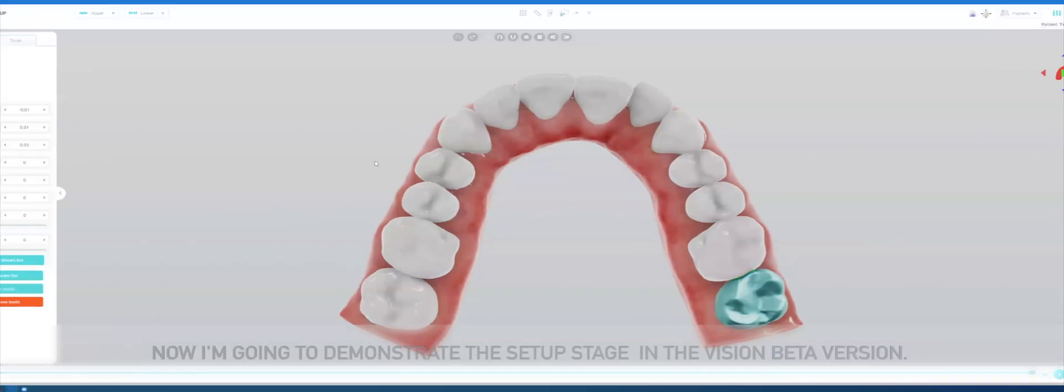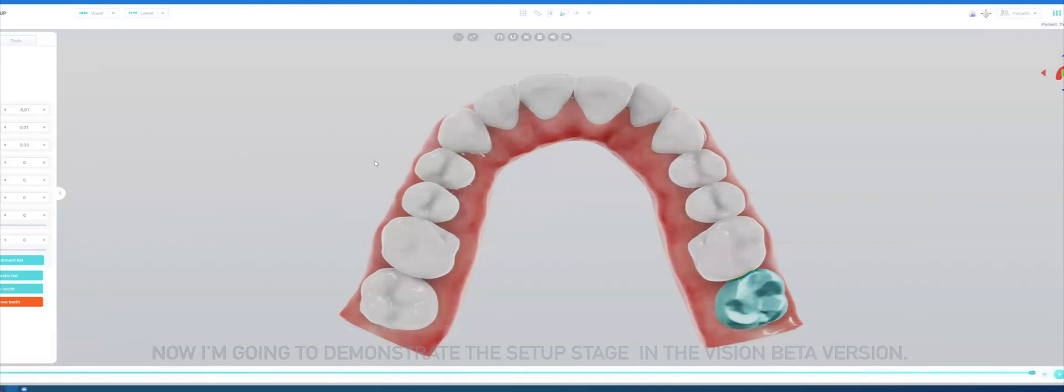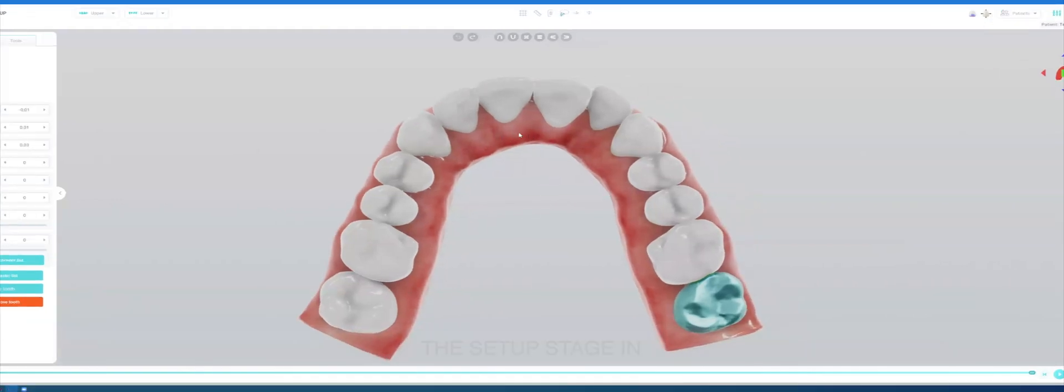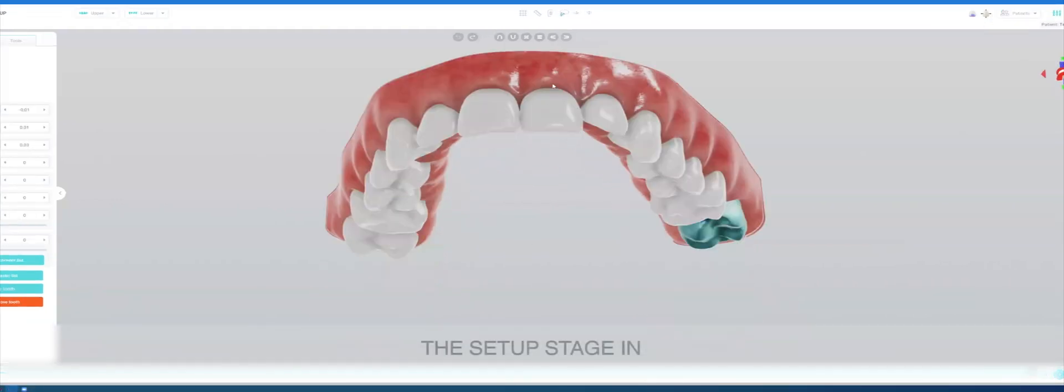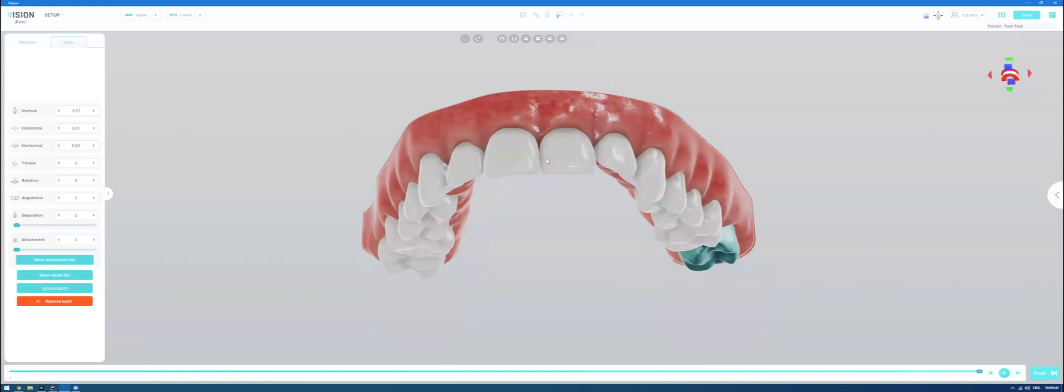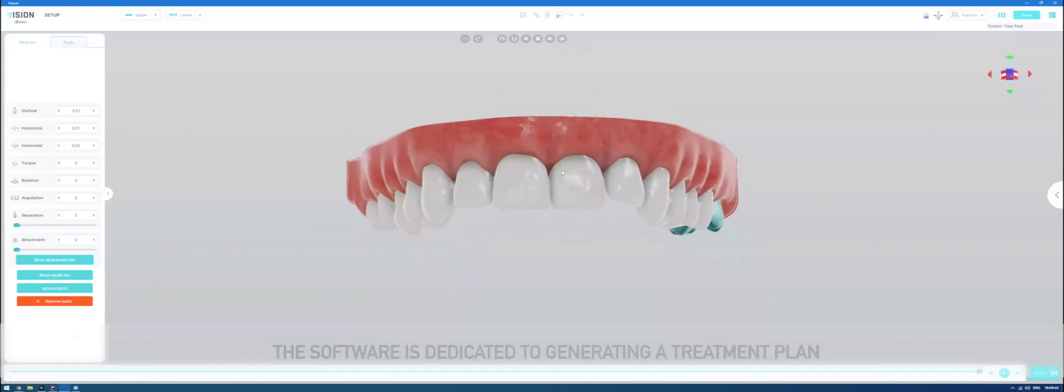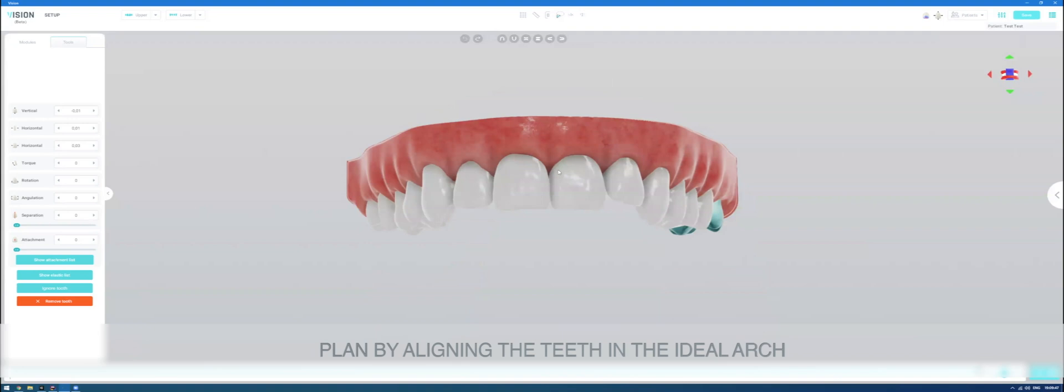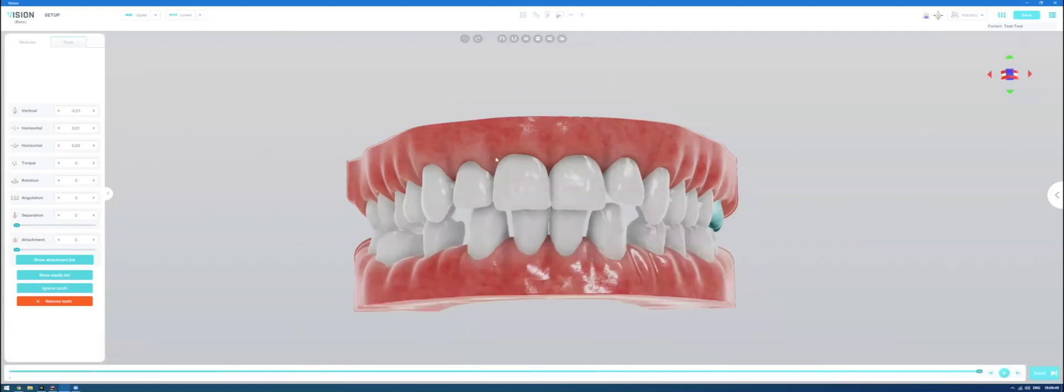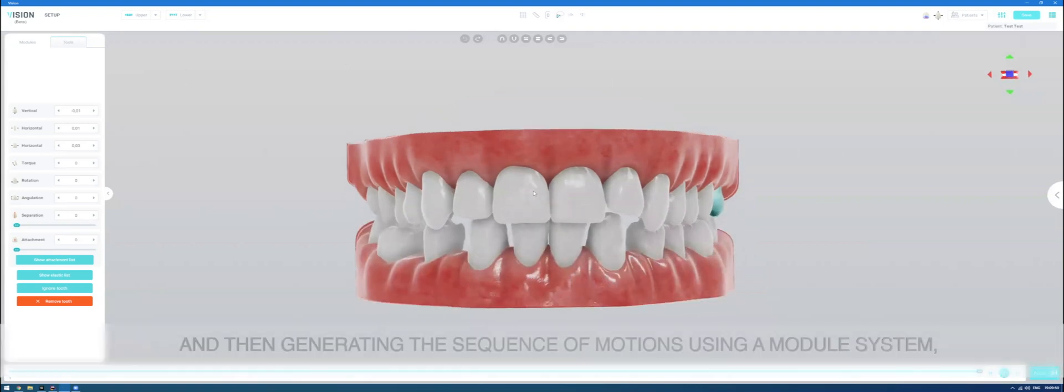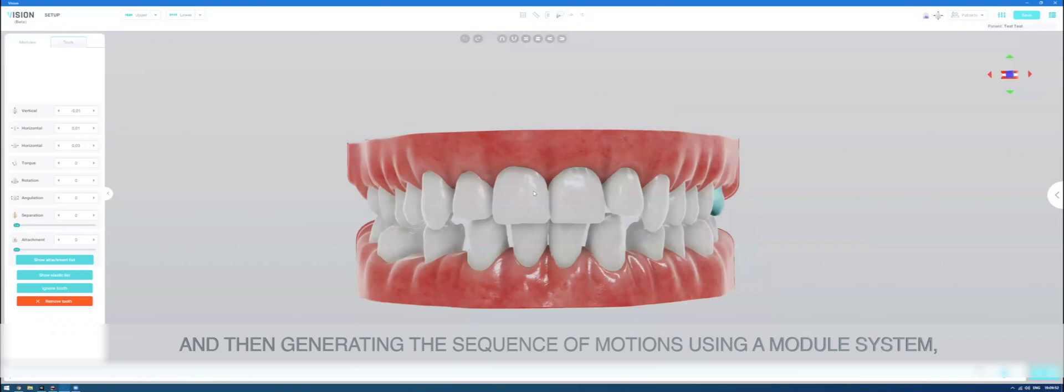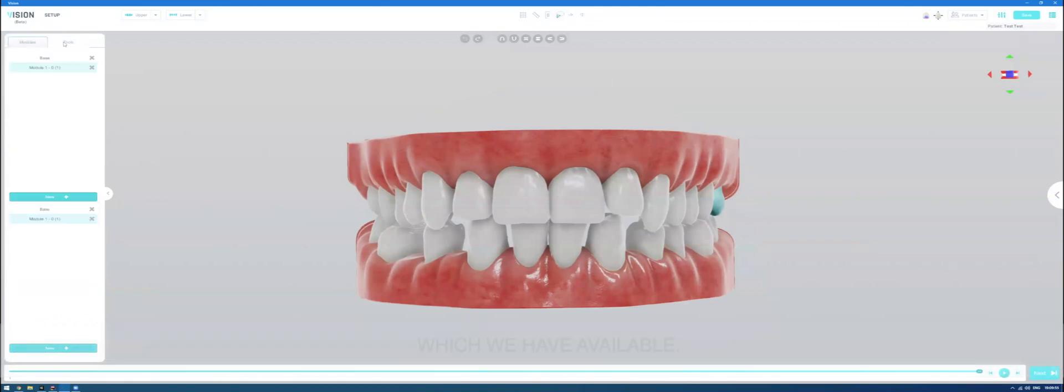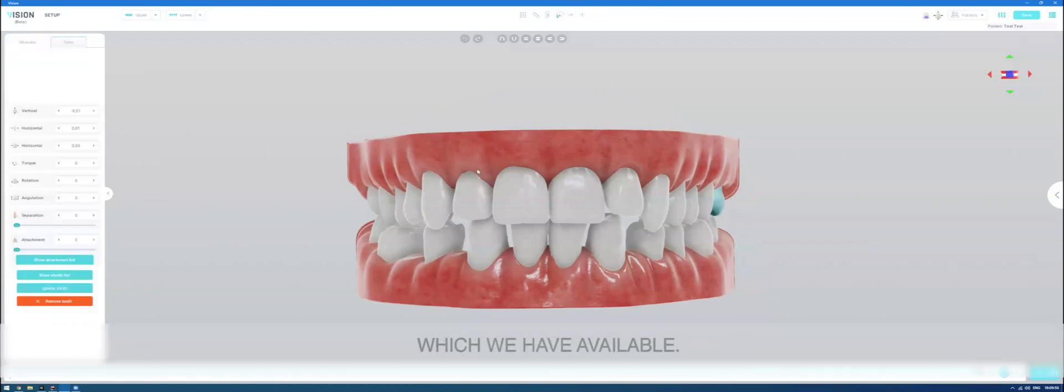Now I'm going to demonstrate the setup stage in the vision beta version. The setup stage in the software is dedicated to generating a treatment plan by aligning the teeth in the ideal arch and then generating the sequence of motions using the module system which we have available.